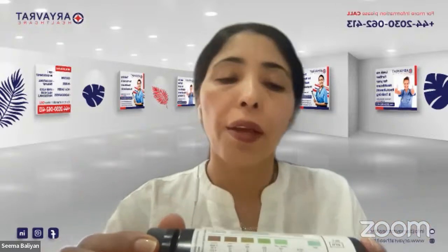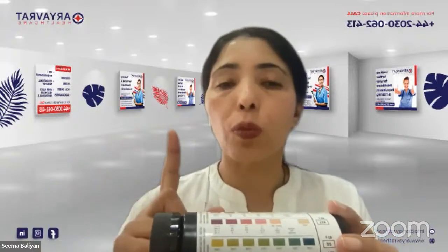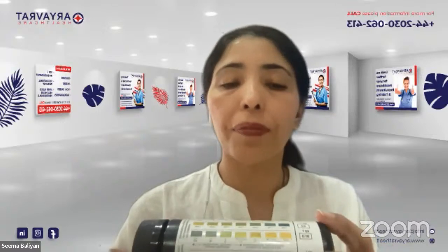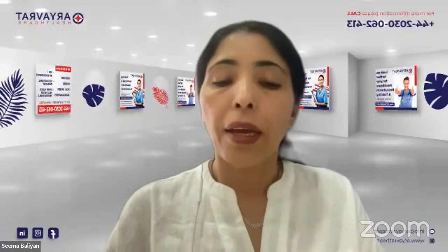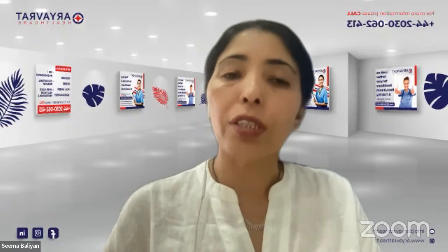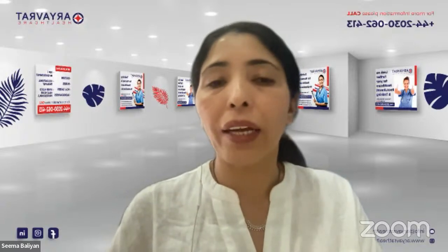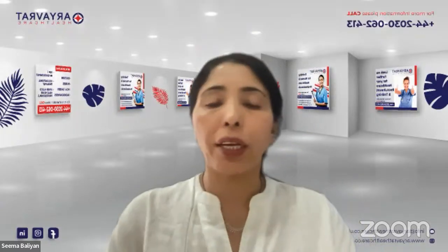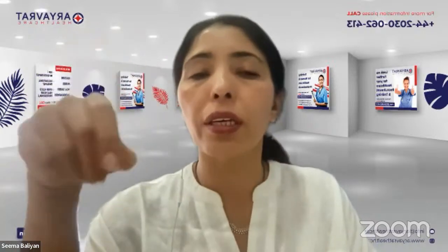And as per the seconds, you are going to be checking at what time you should be checking for what parameter. For example, glucose you will check first, at 30 seconds. Ketones, you will check at 40 seconds. Specific gravity, you will be checking at the 45th second. And then the blood, protein, nitrites, and pH, these 4 things you will be checking at 60 seconds. And at 120 or 90 seconds, you will be checking the leukocytes. So these are the 8 things that you are going to be checking. And as you carry on checking, you are going to be marking what reading you have got.